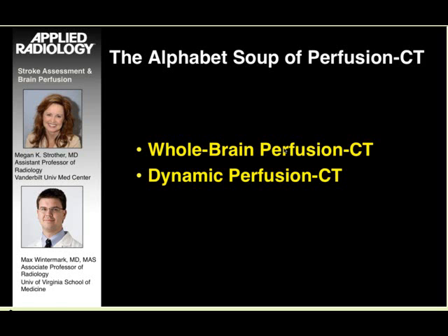And I think it's very important when you are dealing with your own perfusion CT data sets to know exactly what type of perfusion CT technique you are using and to be familiar also with the software that you are using to process your data, because that way you are going to understand your results and you are going to interpret them properly.